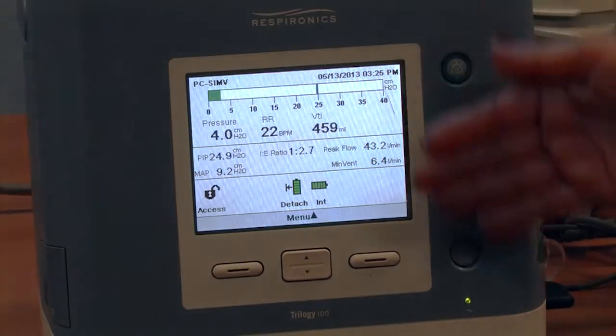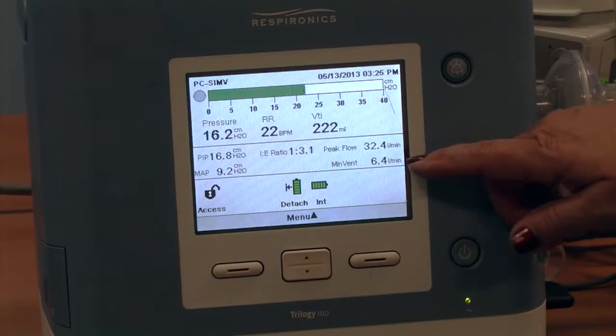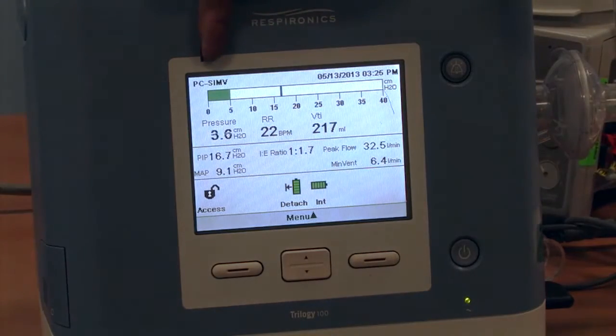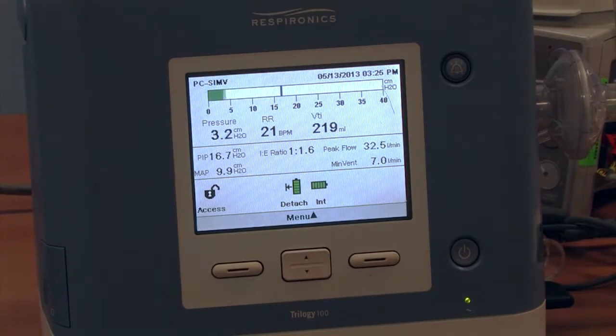So this is where you're going to keep your screen, where you see the breaths happening, where you can see the tidal volumes and the minute volume, where you can see the respiratory rate going on at that period in time, and you can see the trigger. Did my child initiate that last breath, or for some reason are they really sleepy? A lot of children do go home from the hospital still with some sedative medications as they continue to recover.